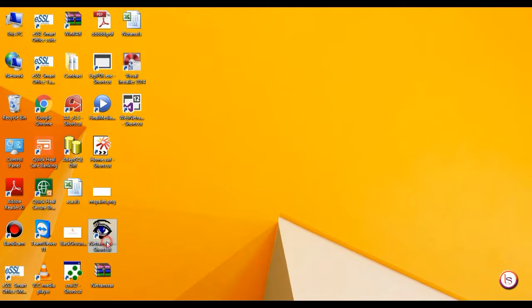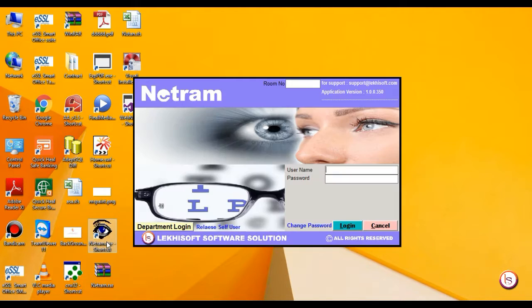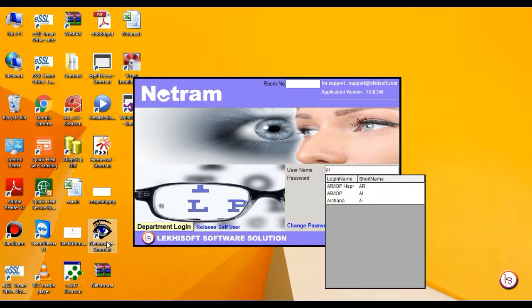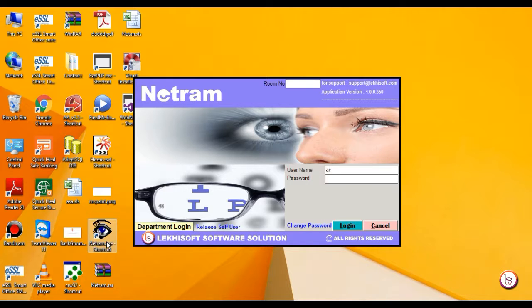Double-click on NetRum desktop icon. It will switch you to login screen. Fill in the user name and password and press enter.